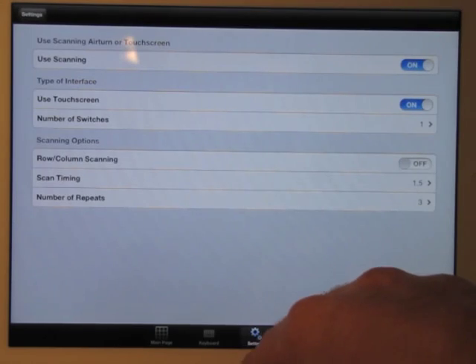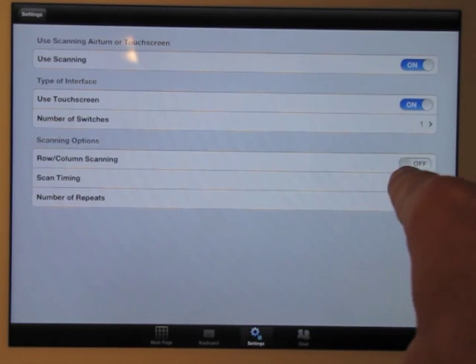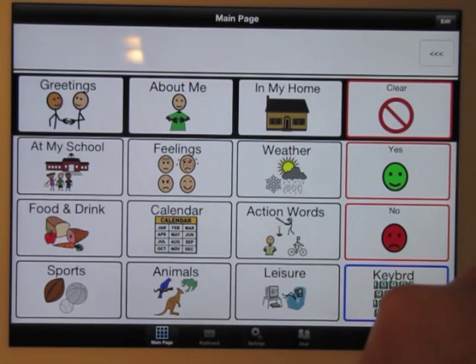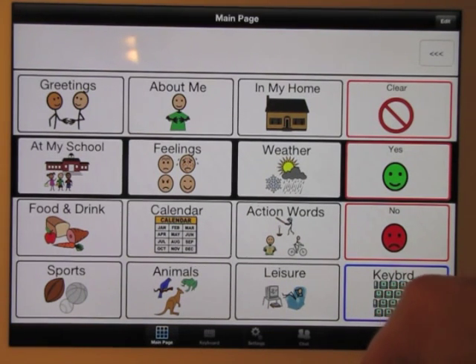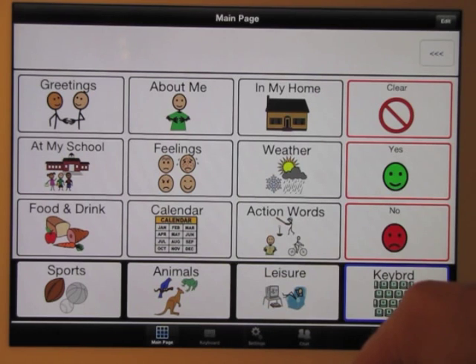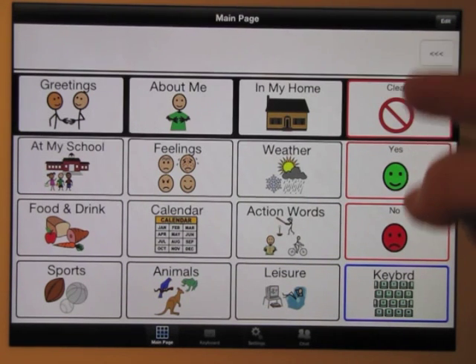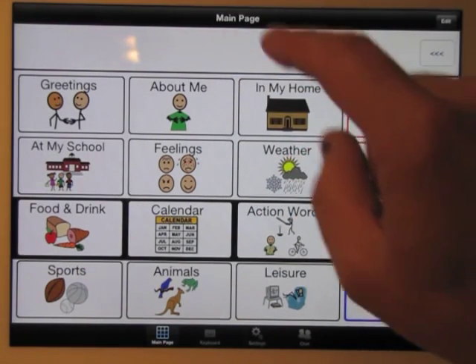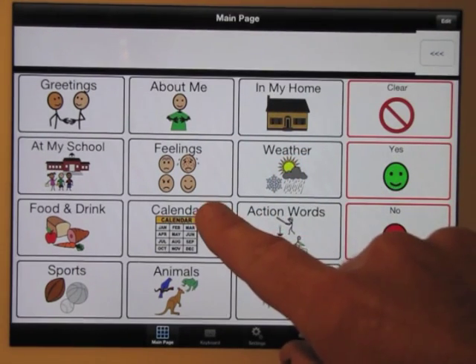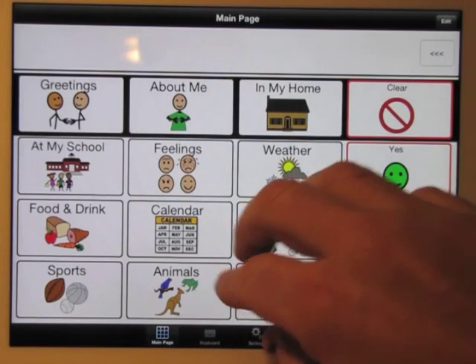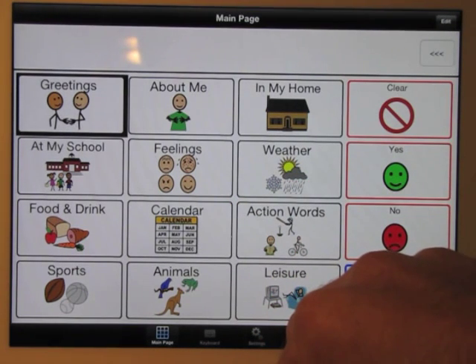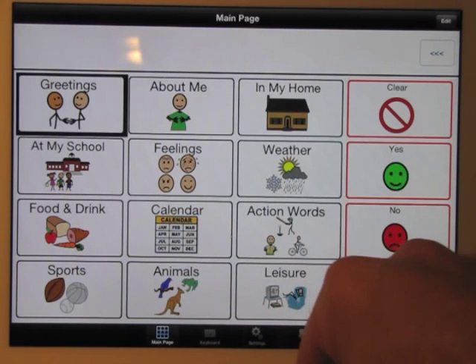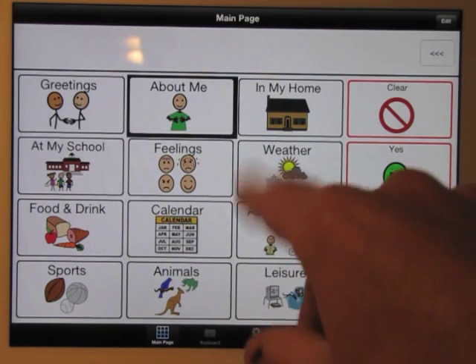Let's go back into settings — one switch, let's turn on row column. This is a very common way people have seen switch scanning access over the years. It goes down one row after the other and then highlights the message bar. So if I wanted to go into 'About Me,' I wait until that first row is highlighted and touch anywhere on the screen, and now it will go across the row. I can also change the speed — right now it's set at 1.5 seconds per button, but I can change it to whatever I want.